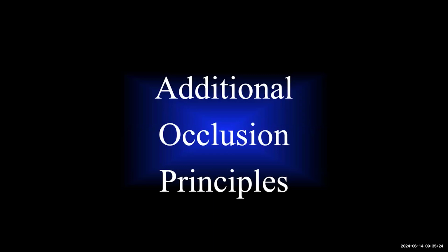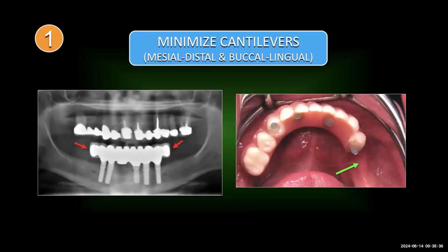At the very end of the webinar, I'll go through the different scenarios so you can understand the different clinical situations that you might contend with. What are some other occlusion principles for full arch fixed prostheses?